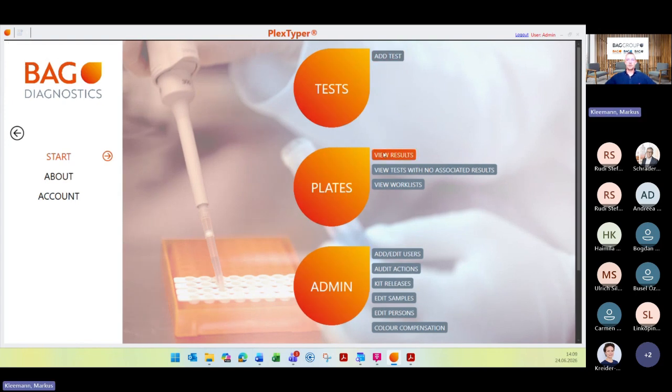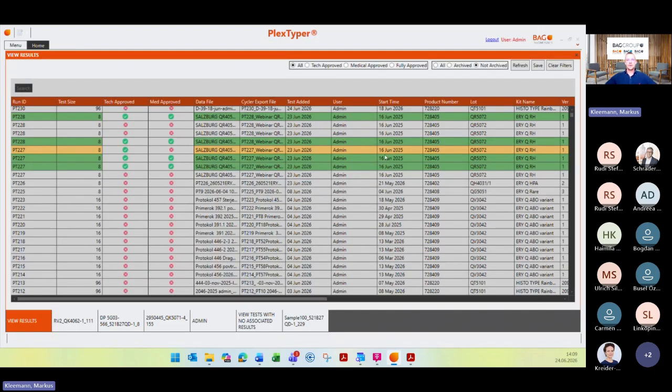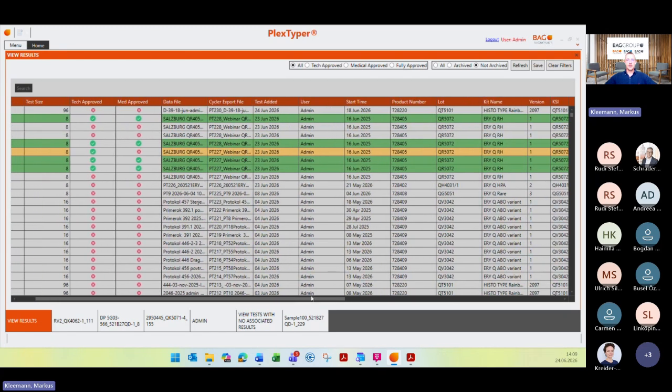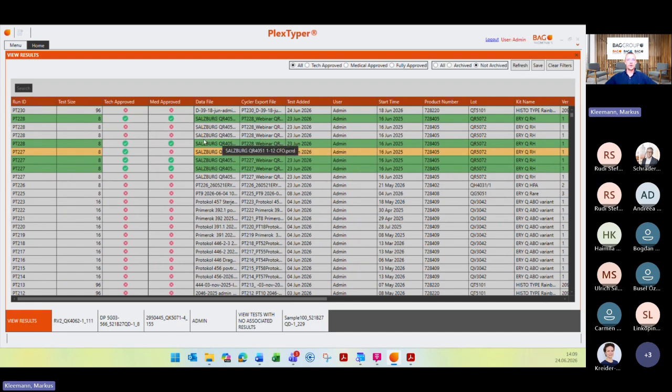With this, I go to the view results database. I think you also know this, this is the database where you can find all your run tests. So what you can see here is the run ID from PlexTyper. You know that whenever you create a new test, PlexTyper gives this test a new PT number. So when I create a new test in a few minutes, you will see that it is PT231. You can again filter different things, and maybe one thing I want to point out here is this somehow new field, the tech approved and the medical approved function.